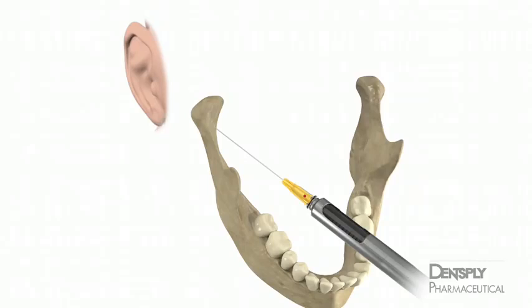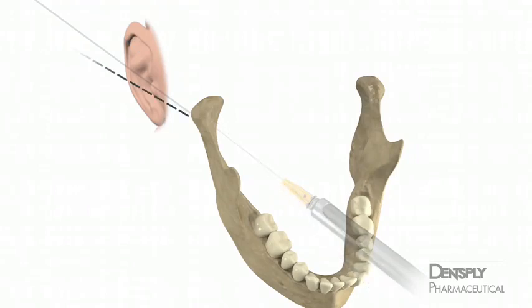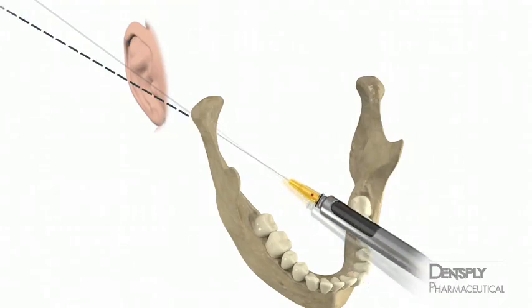Perhaps the most challenging aspect of this injection is determining the proper angulation of the syringe within the plane of insertion. According to Gow-Gates, the lateral flare of the tragus parallels the proper orientation of the syringe. Normally, the barrel of the syringe is placed over the contralateral canine. For a tragus that lies flat against the face, the syringe will be located anterior to the canine. With a divergent tragus, it will be posterior to the canine.